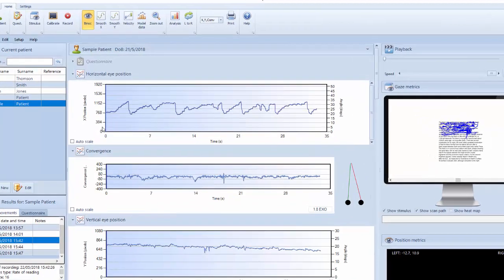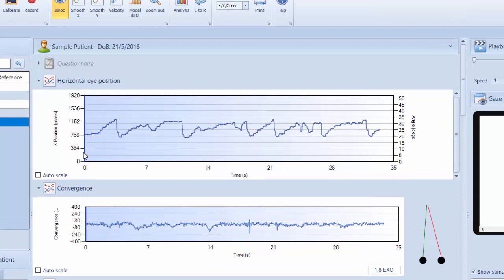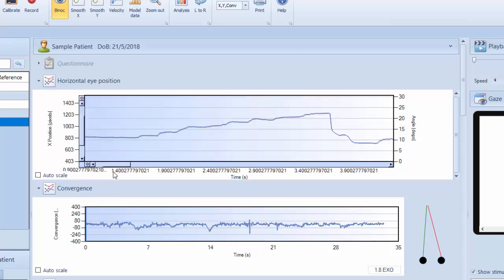So the trace at the top here shows his pattern of eye movements while reading a passage of text. And as you can see, he starts reading reasonably normally. If I just zoom in on this, this is a typical pattern of eye movements while reading: fixating a word, making a saccade to the next word, saccade, fixation, and then a big saccade at the beginning of the row, ready to take up fixation at the beginning of the next line.